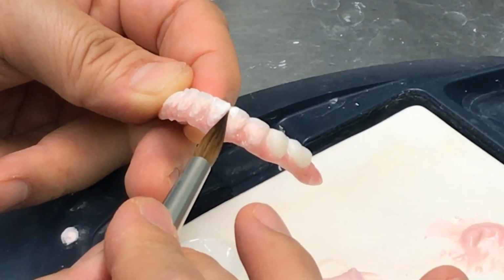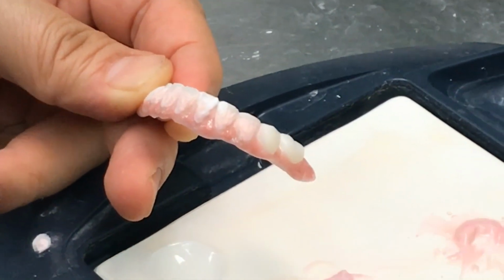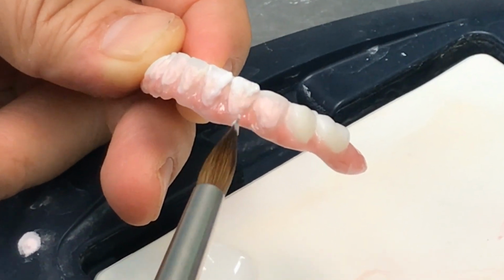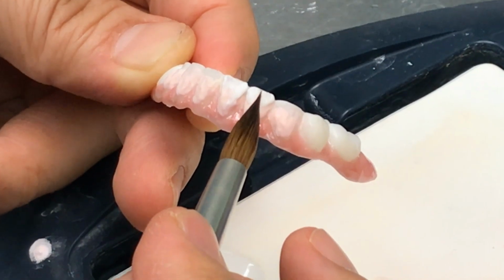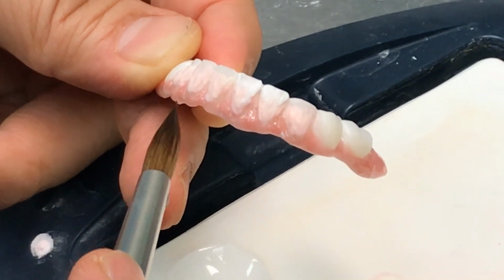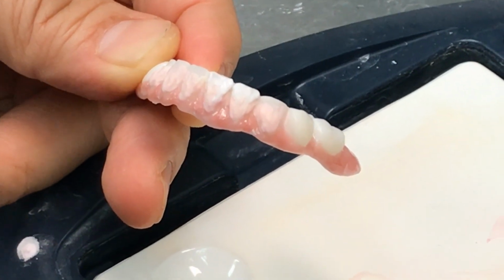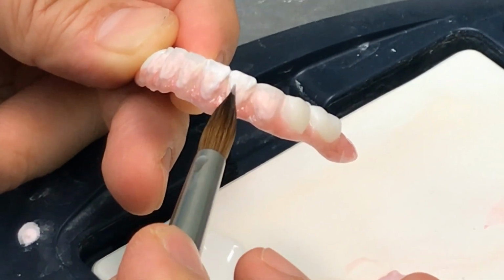Full mouth zirconia, only facial layer anteriors. It's pretty simple. We already set the color based on the A1 underneath color. So all I can do with the created is a little bit darker color, to compensate the color in order to match the final base A2.